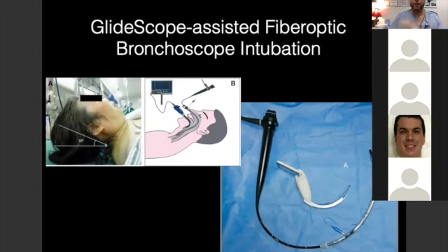So I look at the patient, they've been topicalized. They had their neb, 4%, 4 cc's of lidocaine at 6 to 8 liters per minute. That's completely gone in. Maybe I'll assess gagging by putting a Yankauer in before I start. So let's say I have my remifentanil running. I'm at like 0.1 mics per kilo per minute. Respiratory rate is 8. Topicalization is done. I'll put the Yankauer in, and if they gag, I might say, I have to go up on my Remi. Or maybe I have to topicalize better.